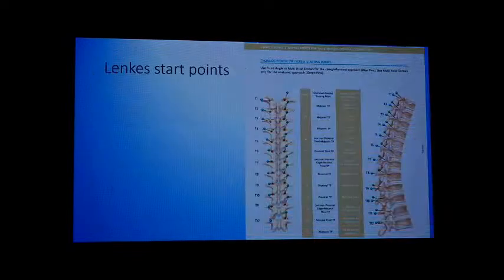So based on this, this Lenke's chart is very popular. The Medtronic people actually give this chart. They have this poster put up. So you can see the different start points for this.